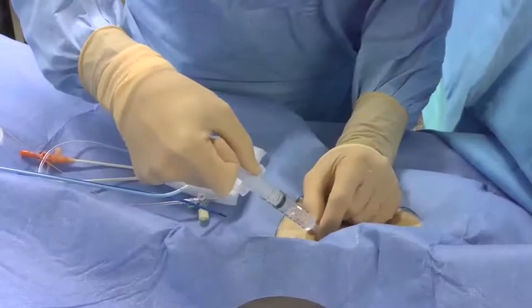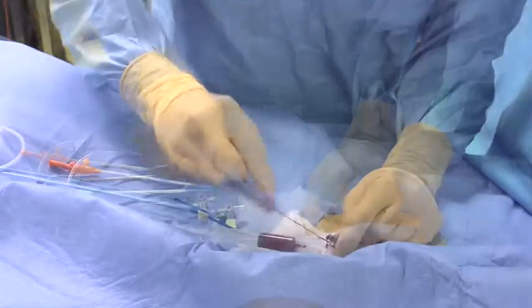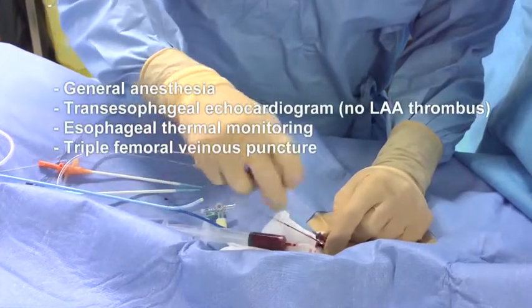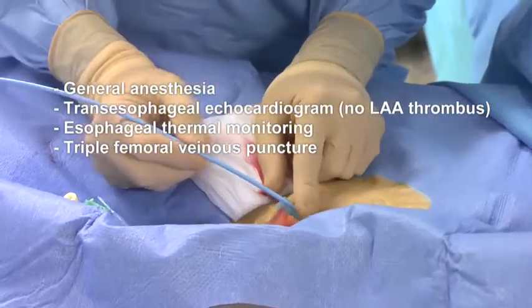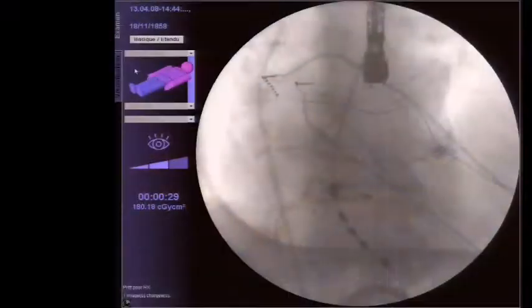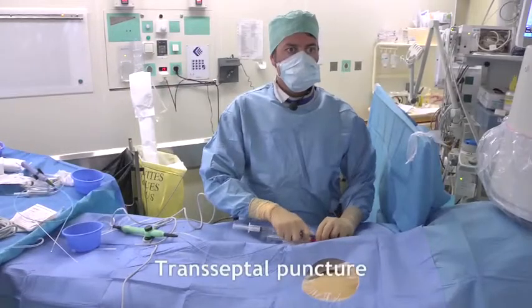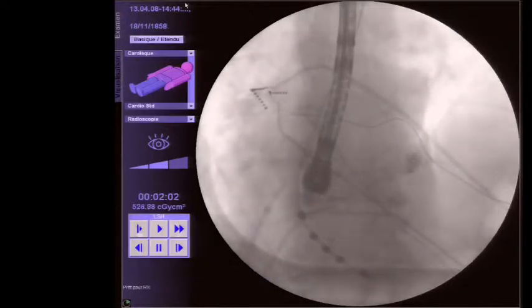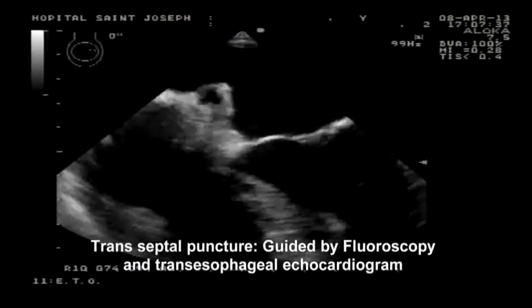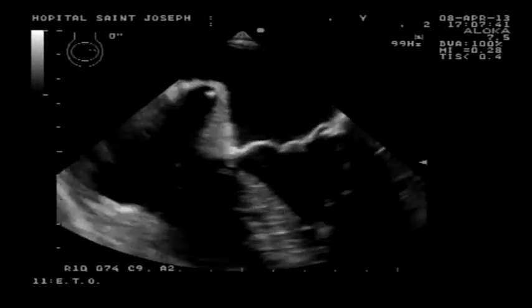The procedure is performed under general anesthesia. A triple femoral puncture is performed. A thermal probe is used to monitor esophageal temperature during ablation. A decapolar catheter is positioned within the coronary sinus. I'm on the septum. The transseptal puncture is guided by fluoroscopy and transesophageal echocardiogram.